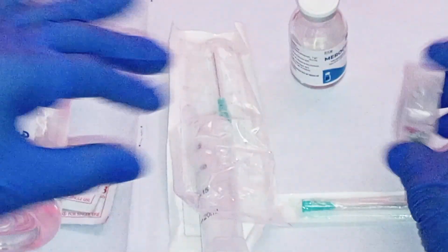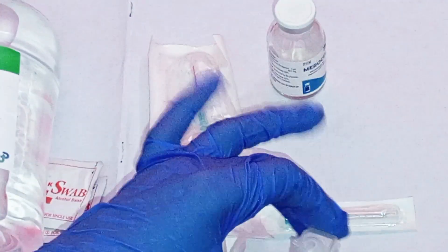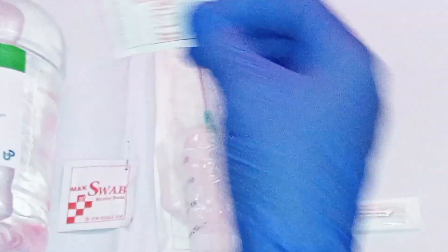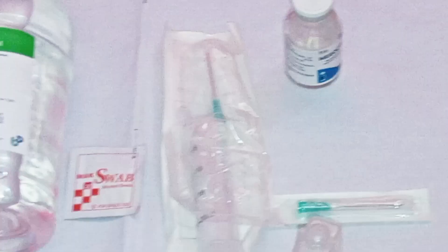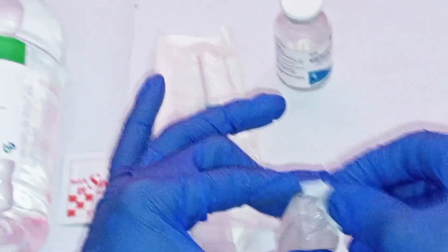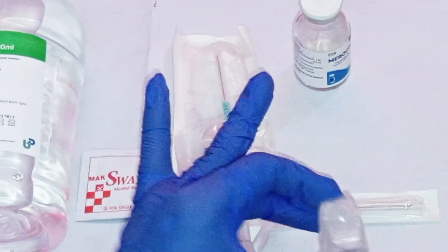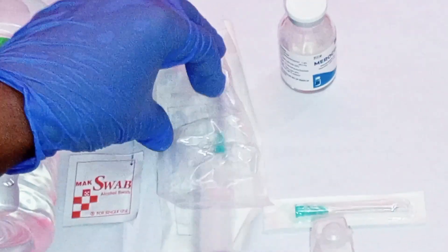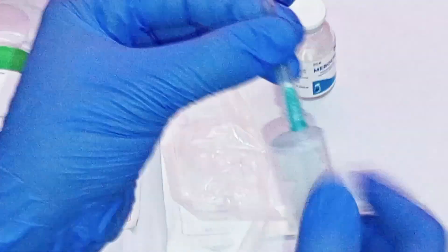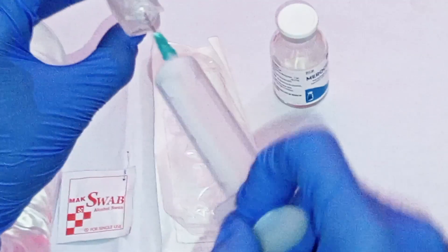Get the sterile water for injection in the plastic vial. Flip off or open the plastic vial. Get an alcohol swab and clean the opening of the vial — make sure you clean it thoroughly. Then get the syringe from the packaging and remove the cap of the needle. Hold the plastic vial horizontally.